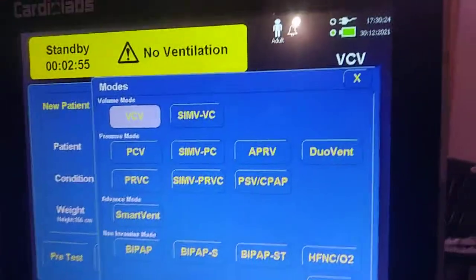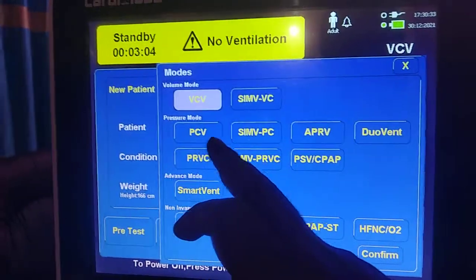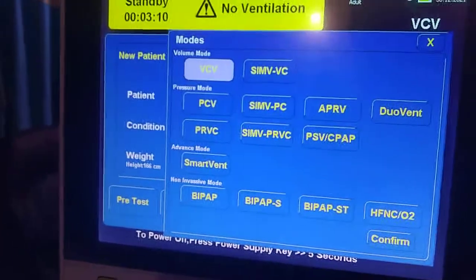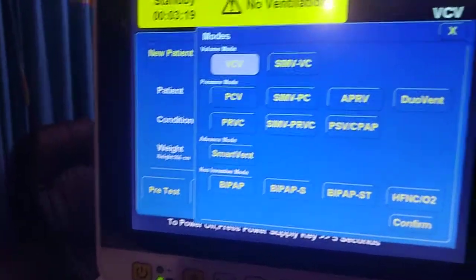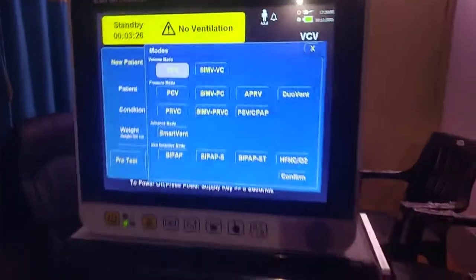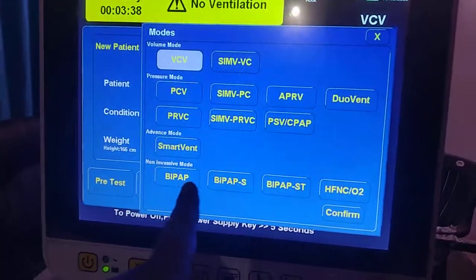This machine has all modern modes: VCV, SIMV-VC, PCV, SIMV-PC, APRV, DUO Vent, PRVC, SIMV-PRVC, PSV, and CPAP. It also has Smart Vent — with Smart Vent, clinician intervention is minimal because you target a minute ventilation and the machine adjusts automatically according to the patient's breath and lung condition to reach that target. We will discuss Smart Vent in a later video.